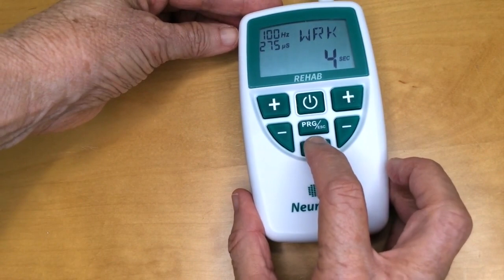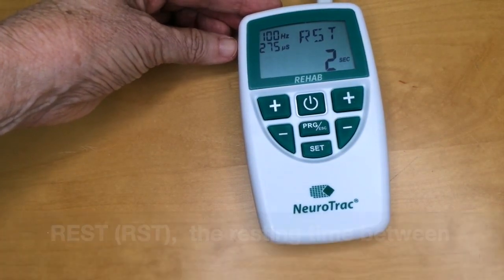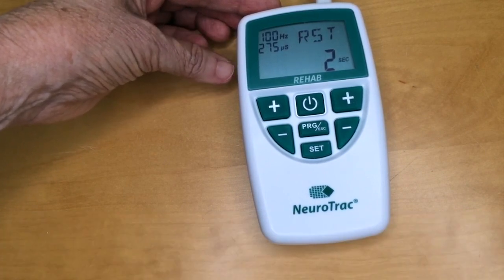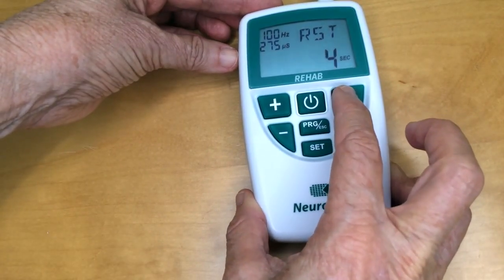Next is rest — the resting time between muscle contractions. It can also be set from 1 to 99 seconds using the plus and minus buttons to adjust it.